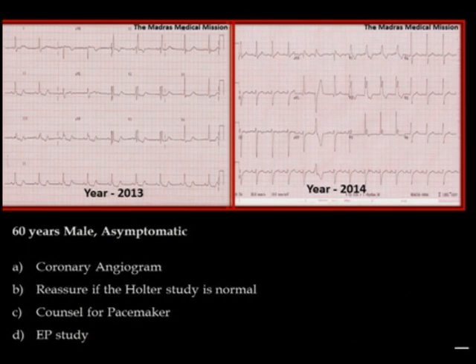No, you don't. You ask him for a Holter because there may be blocks underlying. So you assure him only when it is normal, or you start straight away asking him now to think about a pacemaker because you have got serial ECGs with you. No, none of these things will help. Electrophysiology studies specifically looking at the HV interval may help, so you recommend an EP study.